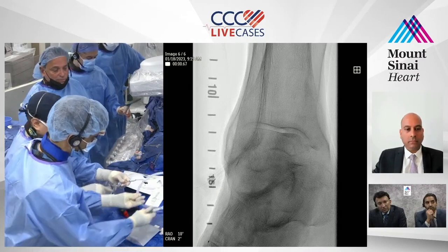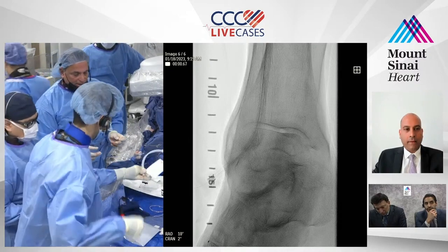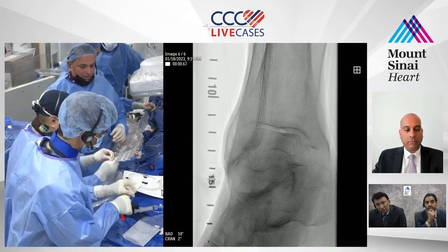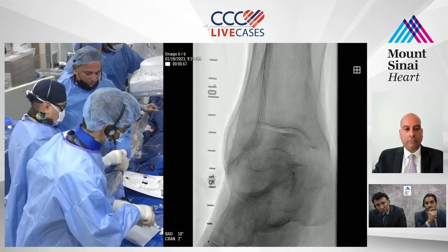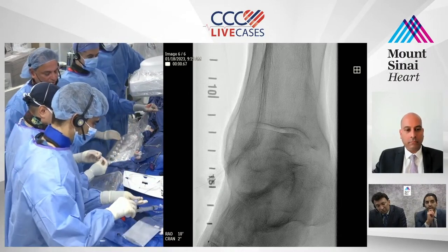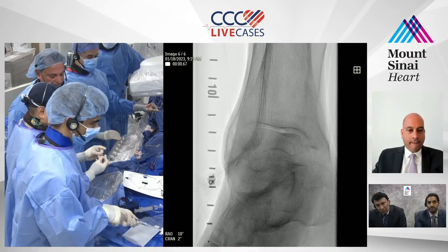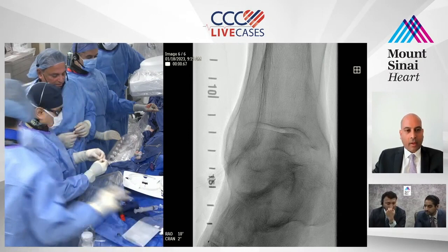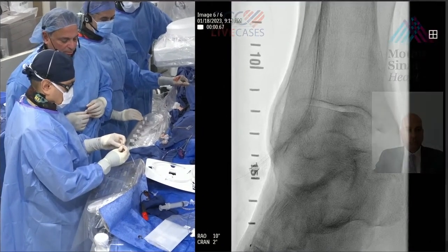Right now, because we have through and through access, and we have what's called a safari, there's really nothing we can't get through this. So you don't want to give up that through and through access first. It's good if I can push the shockwave up across, balloon it, and then establish flow. Once I establish flow, we can do what Vishal said: put a microcatheter in, shockwave the distal, and then do this. So what I want to do is just do one shockwave, and then exchange the wire.